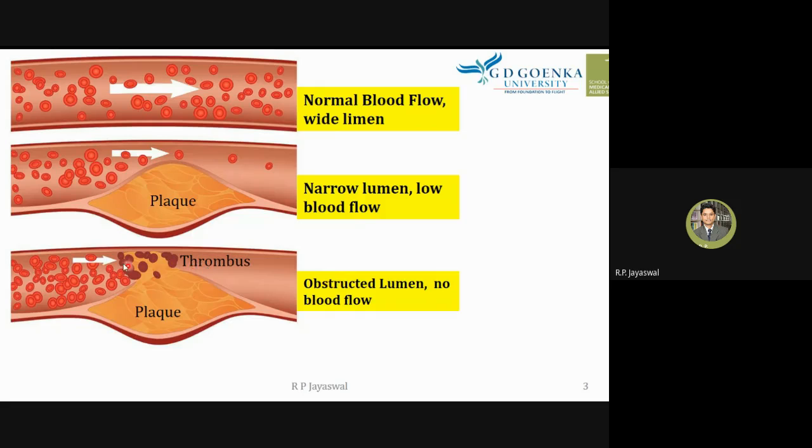Thrombus is a clot. Blood may clot because of some internal mechanical damage, or when the blood flows through this plaque.